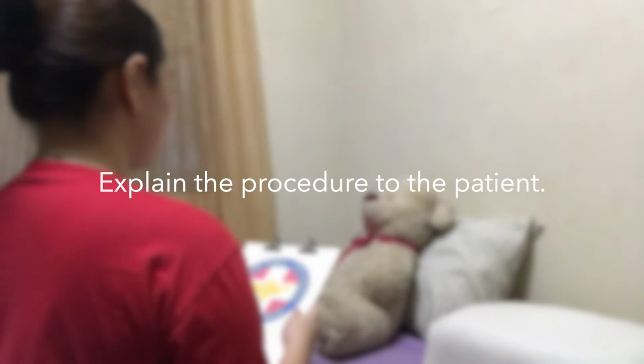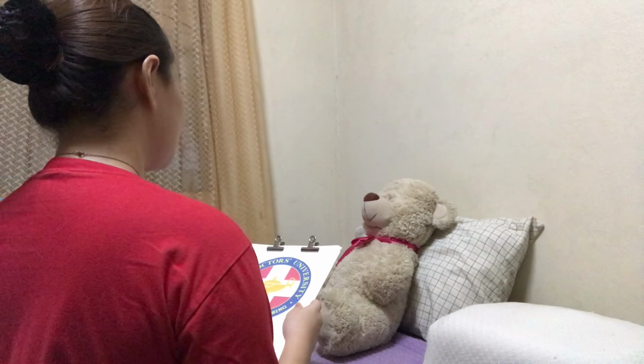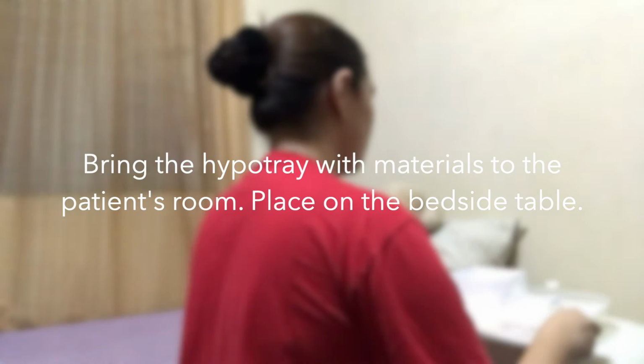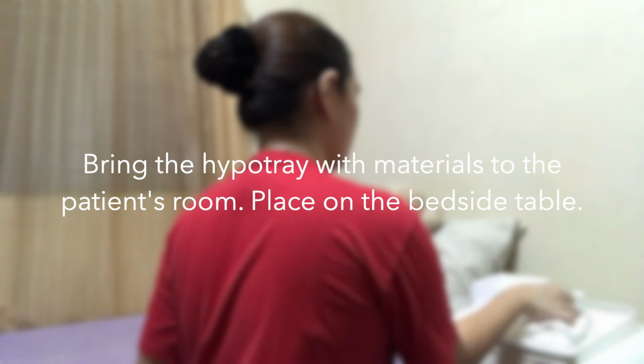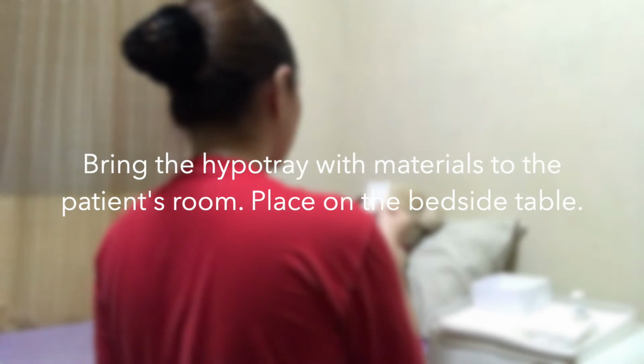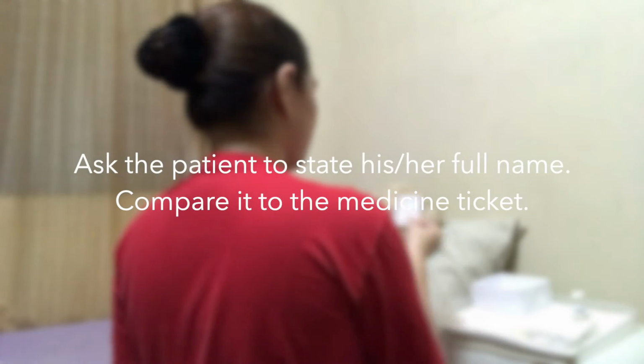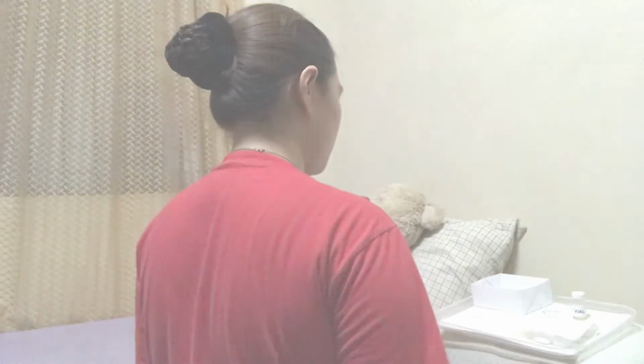Next, we need to explain the procedure to the patient. This relieves the patient's anxiety and promotes cooperation. The next step is to bring the hypo-tray with the materials to the patient's room. Place it on the bedside table. Next is to ask the patient to state his or her full name. Compare it to the medicine ticket.